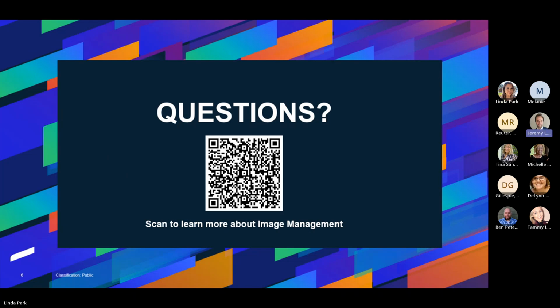Yeah, I'll add one more thing, which is related to the beginning of the call. I mentioned that feature, the modality worklist, which you can search if you want to see some examples. Basically, if you have an imaging device that is DICOM compatible, you don't need to worry about that too much. But essentially, if it's a DICOM compatible device, then we can pull the scheduling information into the device. And that's something that we're going to be piloting.